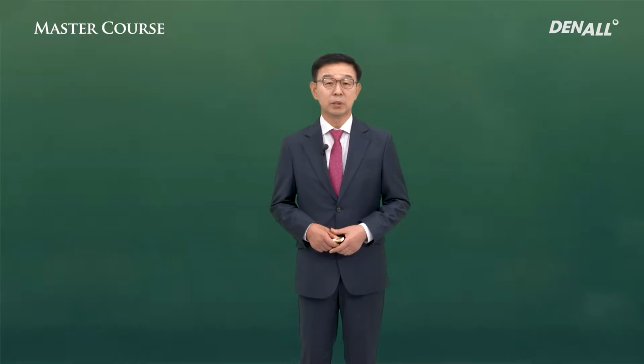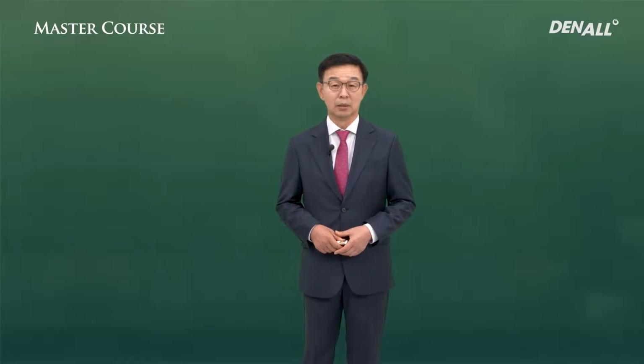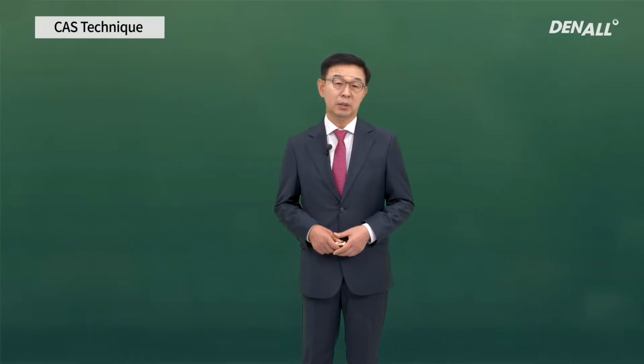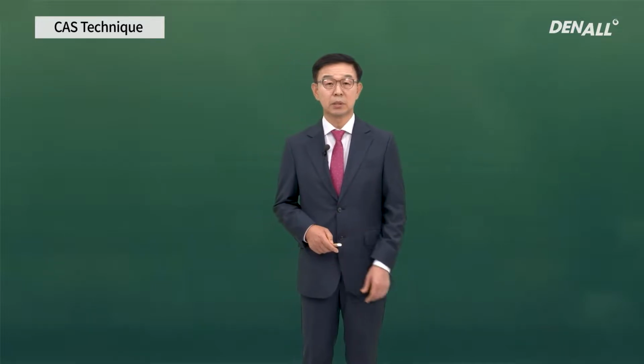The method is comparatively simple and patients recover quickly. Both dentists and patients are very satisfied with this approach. I'm going to talk about the indications and ways to use the CAS kit, which is most suitable for the crestal approach.